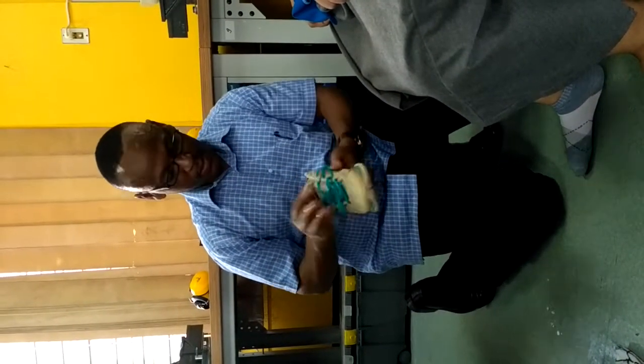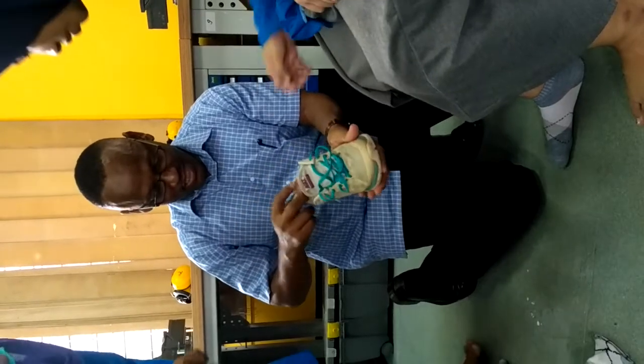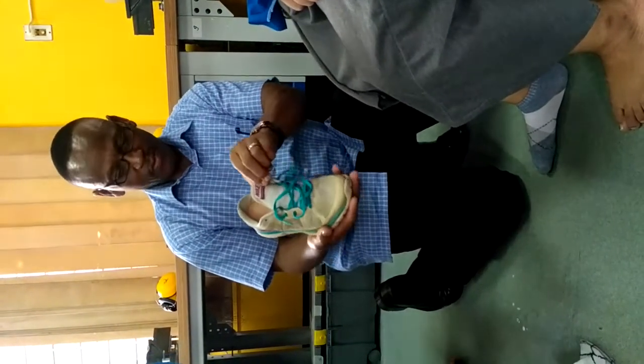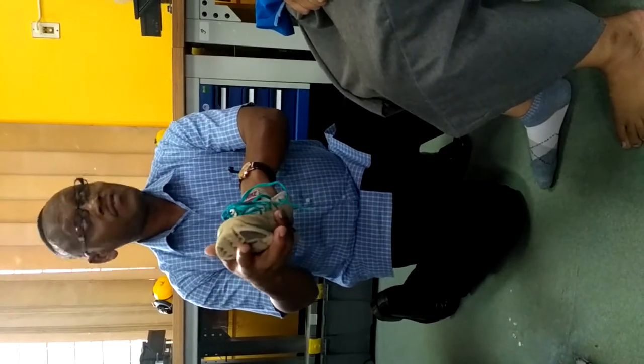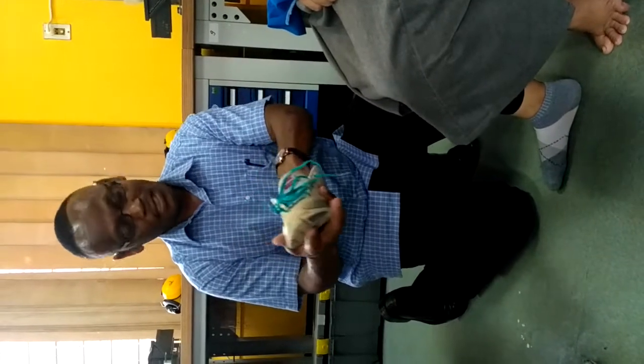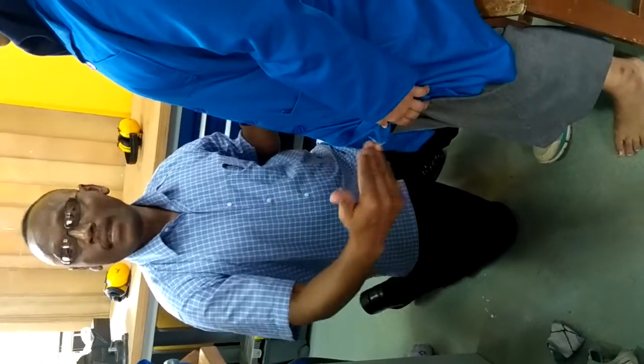Now I am going to put in the orthosis — now the shoe. Make sure when you put your AFO inside the shoe it should be free from wrinkles, nice and fitting in. After that, same procedure — make sure the shoelaces are tightened. Then you can ask the patient to stand up. Before dynamic, check the height; if there's any leg length discrepancy you may need to do contralateral compensation.